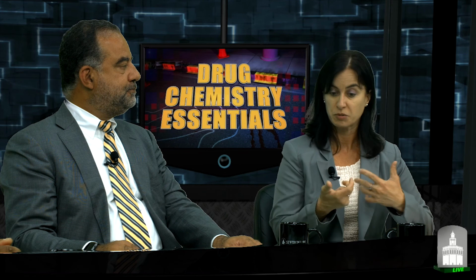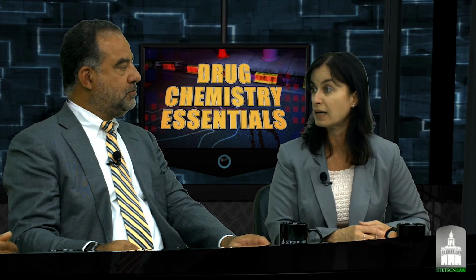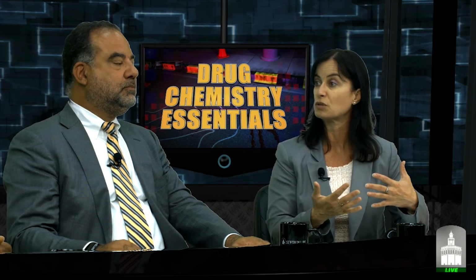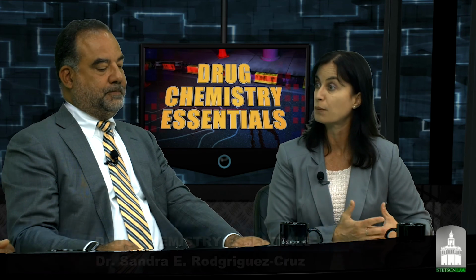How do lab errors occur? Lab errors, these are humans performing these tests. And do we have quality control procedures, quality assurance processes? Yes, absolutely. But typos happen. Inadvertent switching, not of a complete exhibit, but switching of a vial in an instrument with another. We do have procedures to correct for that, and they can certainly be explained. Every time, it doesn't matter how advanced the technique or the machine, if there's a human behind it, performing a calibration procedure that maybe a person forgot to perform, not with any nefarious reasoning behind it. And there again, there are second and third and fourth checks in many of the laboratories.